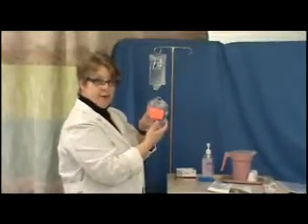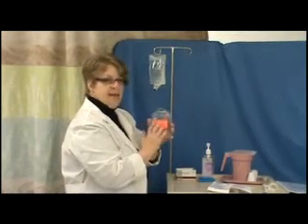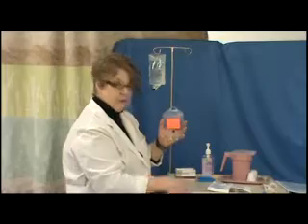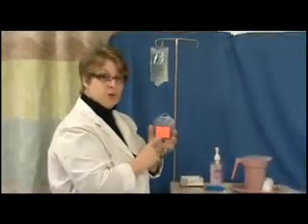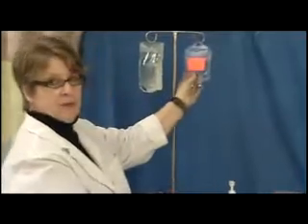And I have my secondary solution. There will be several types of these in the drawer, so be sure that you're choosing the proper dose for your patient. And you hang that, getting that one ready to be primed.